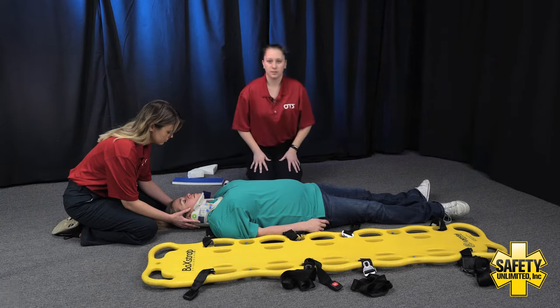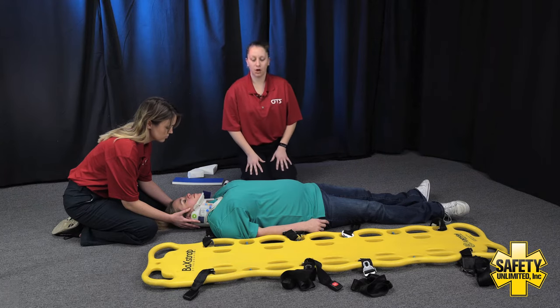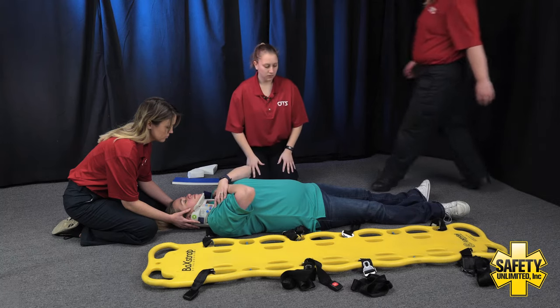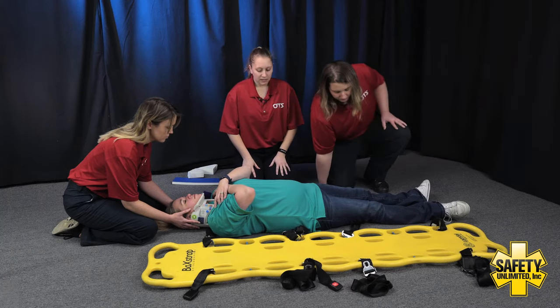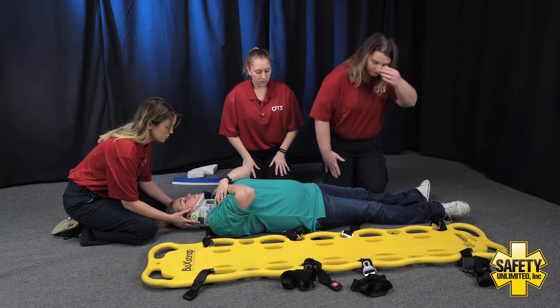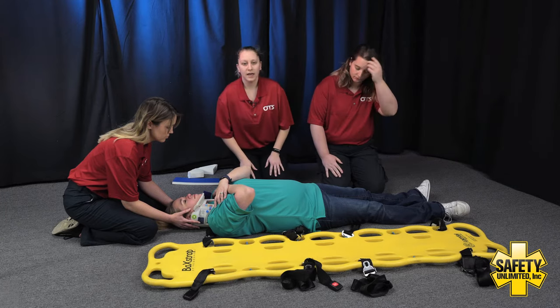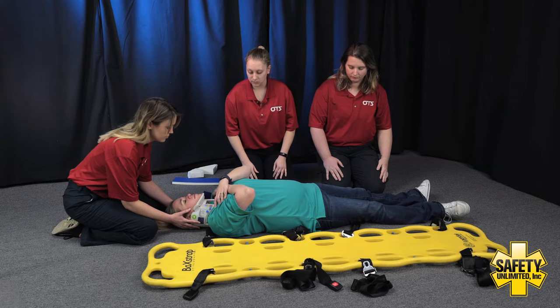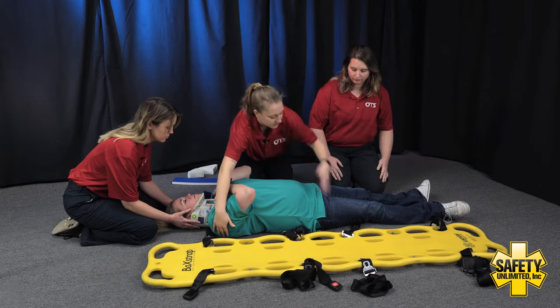Next I'm going to call a second EMT assistant in and we're going to go ahead and do the log roll. Patient, if you could go ahead and cross your arms over your chest for me. With my second EMT assistant, we are going to cross arms across the patient's body, and on the head's count we are going to roll towards myself, which is going to be to the patient's left side. We'll go ahead and get our hands in position.